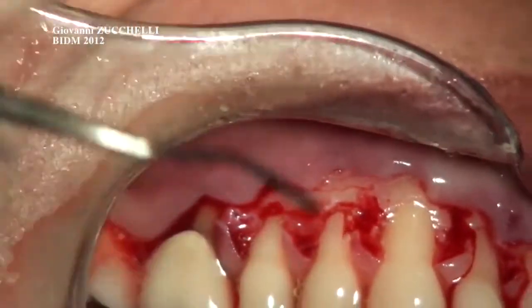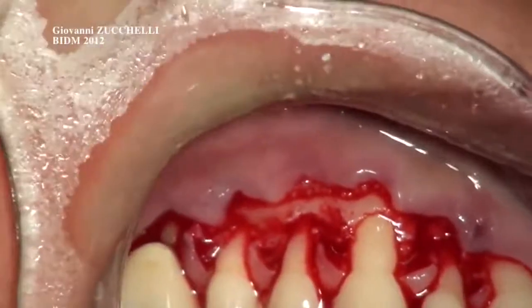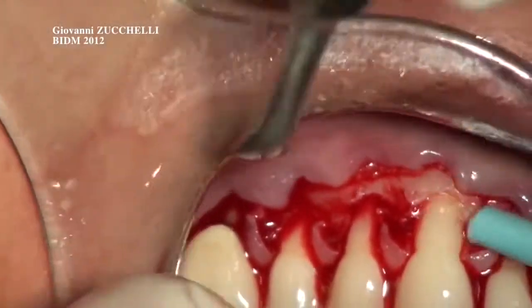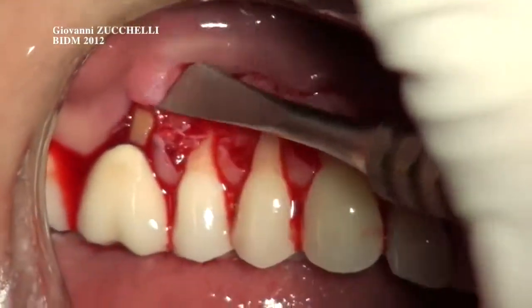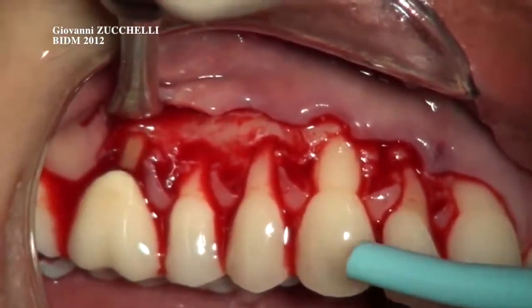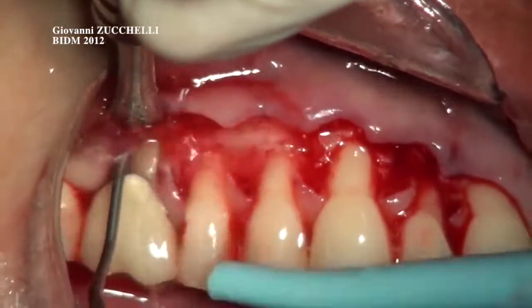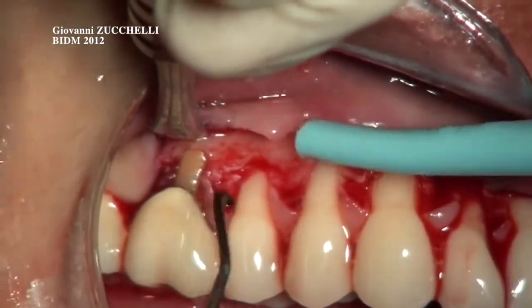Now we go to the molar, and in order to make you see the root planing of the molar, please keep here. I have to just move the flap for a while, so you can see the root of the molar. Please suction here. Okay. That is exposed. That's enough.